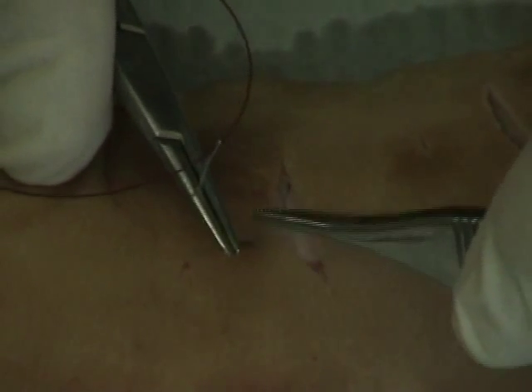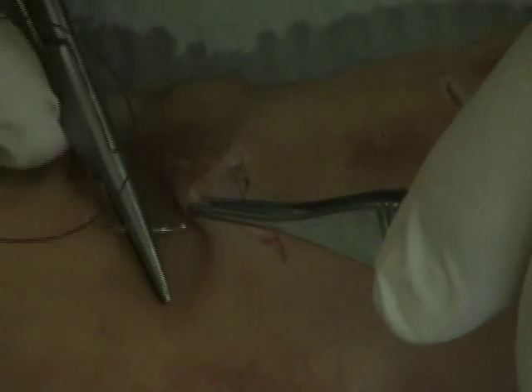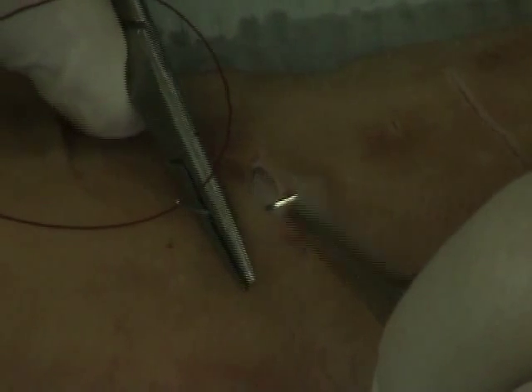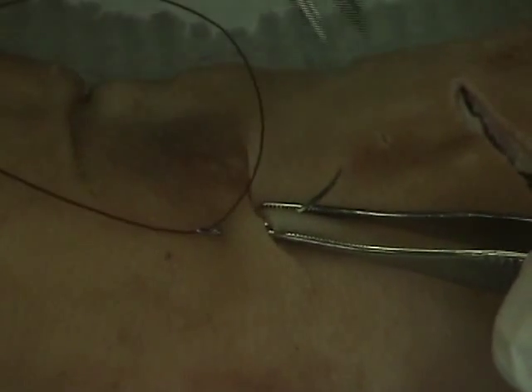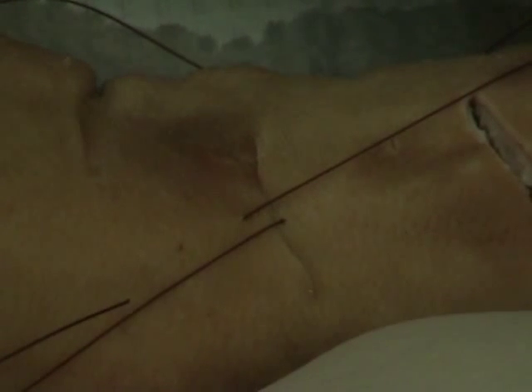So I'm going to go on this side over here, simple interrupted about 1/8 of an inch back from the edge, pull through, go across the other side, about 1/8 of an inch back from the edge again, remember, push through, like such. Okay, I then take the thread and pull the thread across to see how that's closing up. And you can see that's closing up real well.